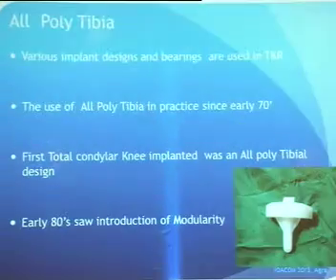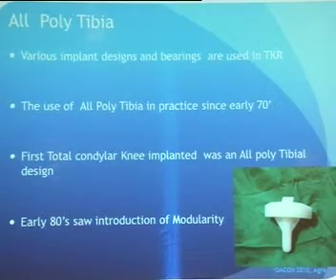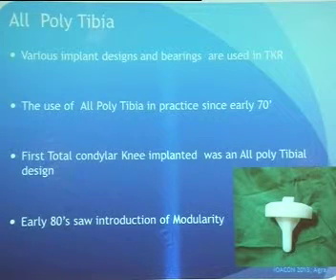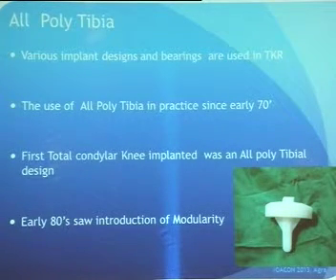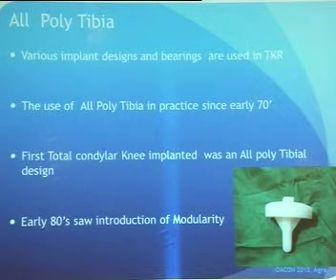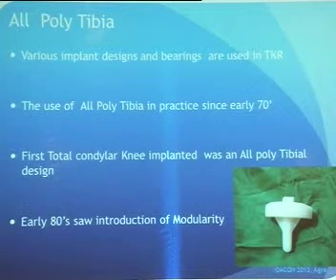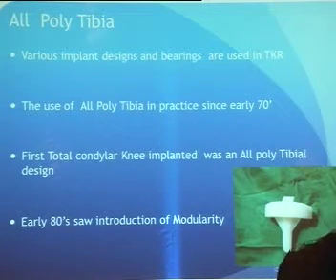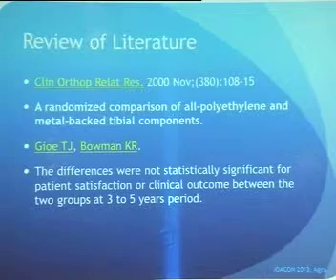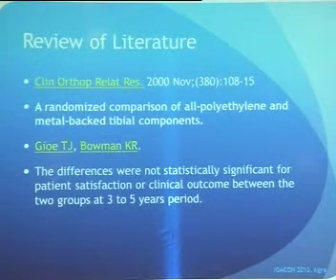Various implant designs have been used in total knee replacement. The use of all poly tibia is in practice since early 1970s. The first total condylar design that was ever put in 1974 was a total condylar all poly design. Early 80s saw introduction of modularity, that's a different metal base plate and a polyethylene insert. Now, because these are two different implants doing the same thing, we reviewed the literature.